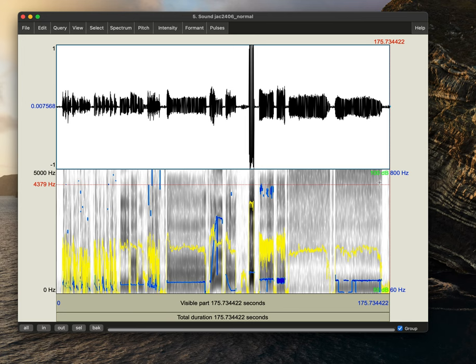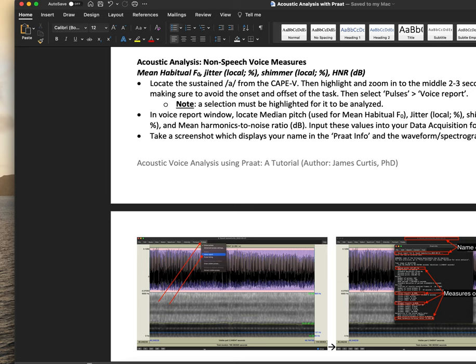Okay, so the first thing that we're going to do is perform our data analysis for our sustained vowel tasks. So this will include our mean habitual fundamental frequency, jitter, shimmer, and harmonics to noise ratio.